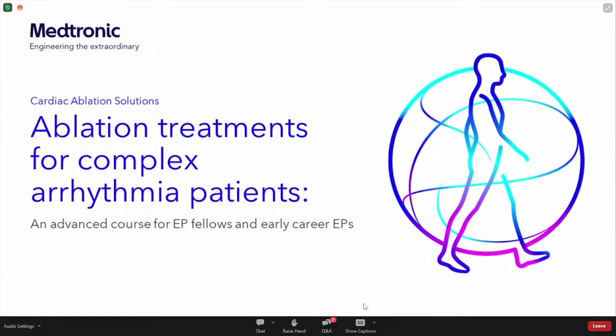And the 5-6 seconds is done to avoid that. Actually, when we started doing the CS, probably in the mid 2000s, we had all those patients followed up with a CT angiogram to look at the coronary artery to make sure there was no problem. And by using the approach that I told you, moving every 5-6 seconds, we never saw any problem. When you sit down for a longer time, that's when you're looking for trouble.